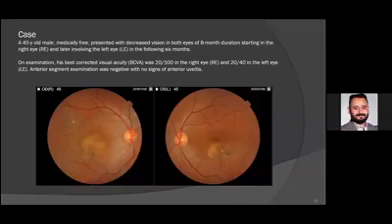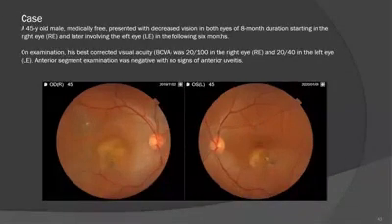Okay, we have a comment from Dr. Abdulaziz. Thank you, Doctor, for this nice presentation. I still have a question about giving anti-VEGF in this case. Since we couldn't find any CNV, even in chronic CSR cases, in my knowledge, if there is no definite CNV, there is no role for anti-VEGF. Okay, thank you, Doctor.